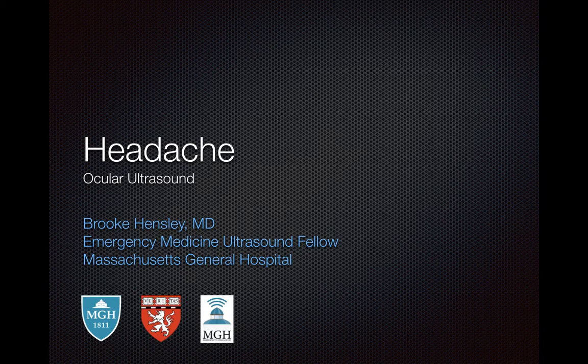Today I'm going to talk to you about a case I had in the emergency department recently where ultrasound helped me narrow down the differential diagnosis for a patient who presented to the emergency department with a headache.